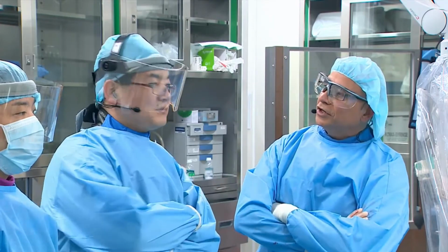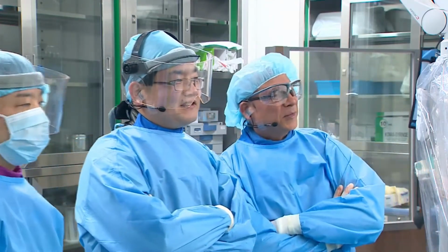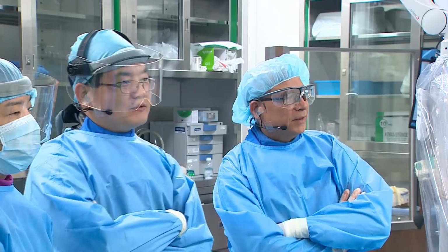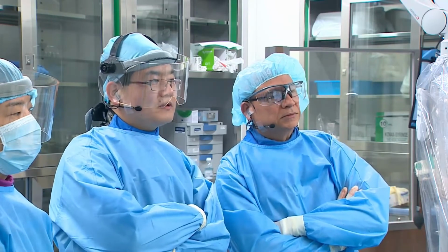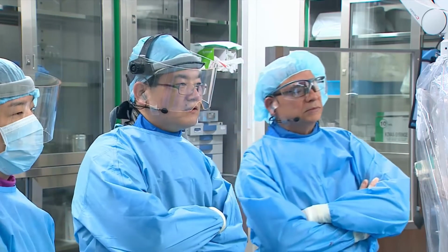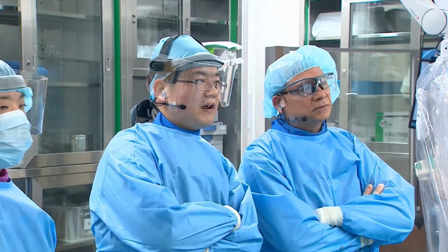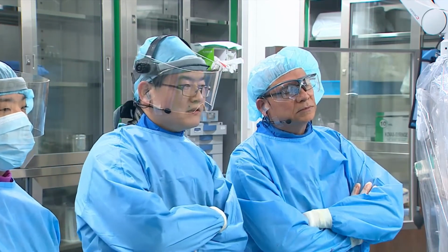Okay. What do you think? Do you agree, Dr. Khan? Okay. So the right side was a little diseased, and the perfusion was not bad. So I think the left side plan was proper for this case. But if there is some compromise or mismatch at the proximal lesions, we could restore the right side also. So how about the plan for the initial wiring? How about the approaches and the recommendations from the panelists?